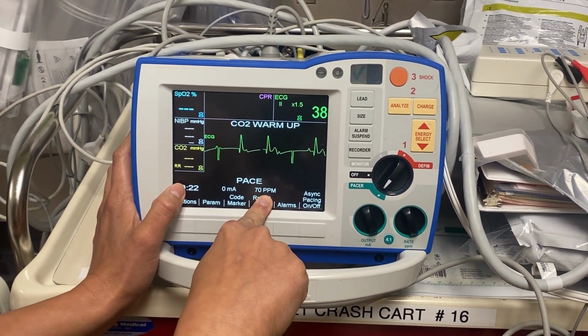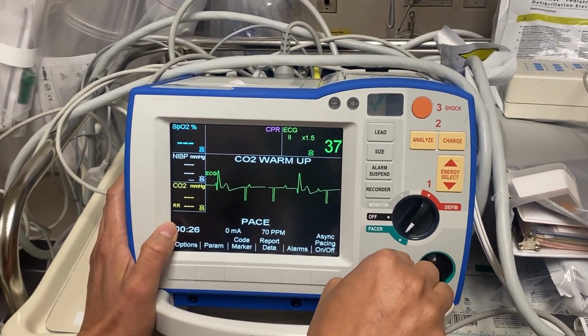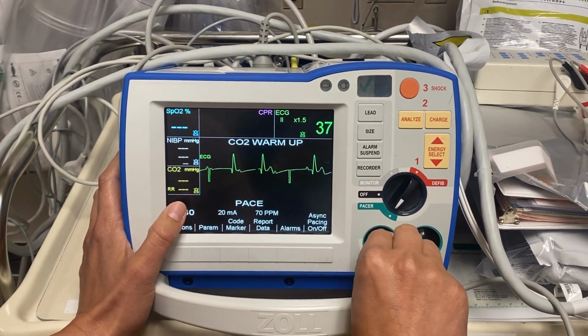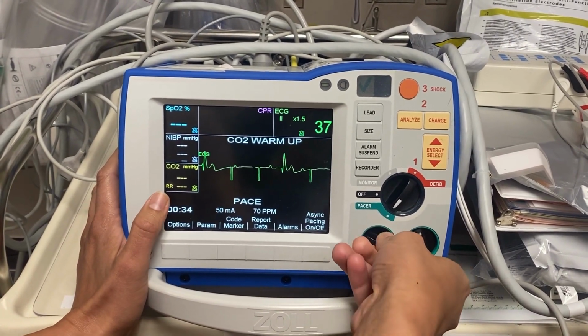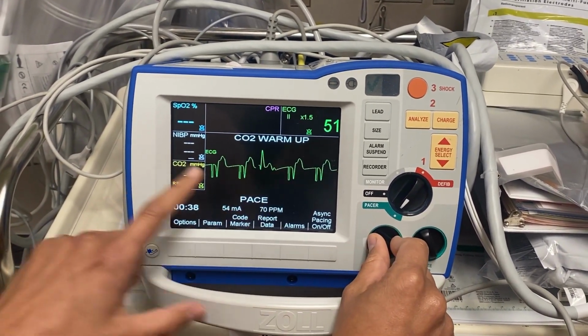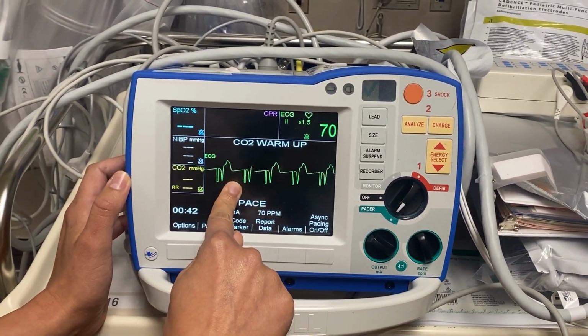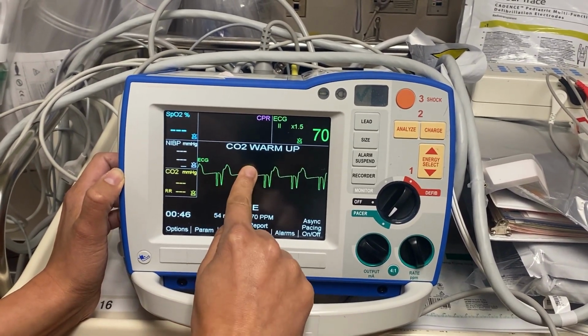When we're going to try to capture, we turn the milliamps clockwise to get the capture. Just keep going up until you get the capture. Like over here, we start getting the capture. The capture is going to show up by the downward spikes followed by a widened QRS complex and extended T wave.